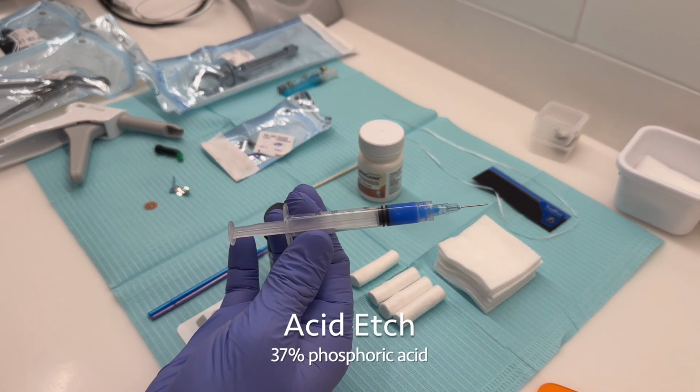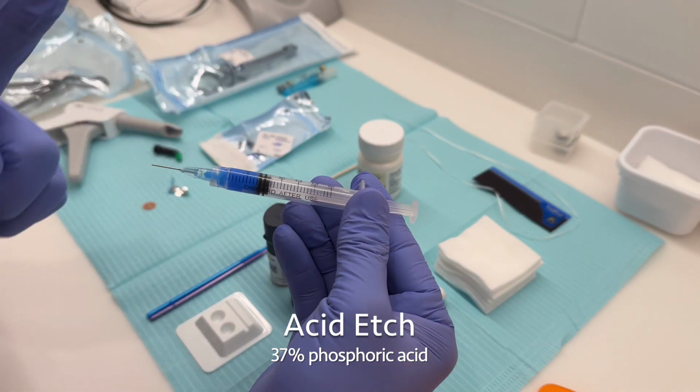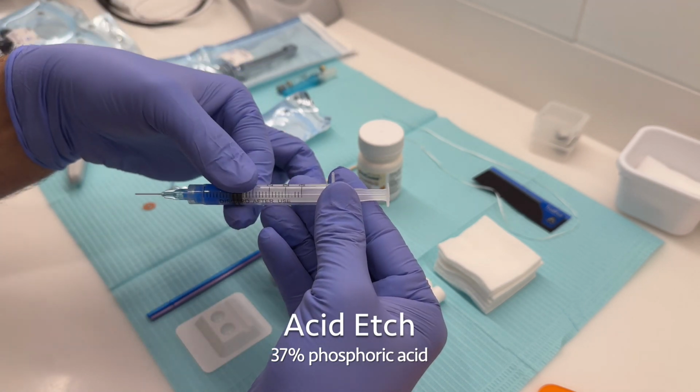The first bit of material is our acid etch. This here is a 37% phosphoric acid. The dentist uses this to remove the smear layer from the dentin in the cavity prep.